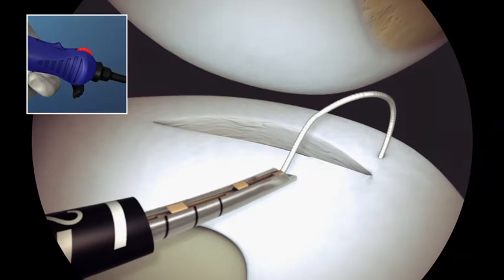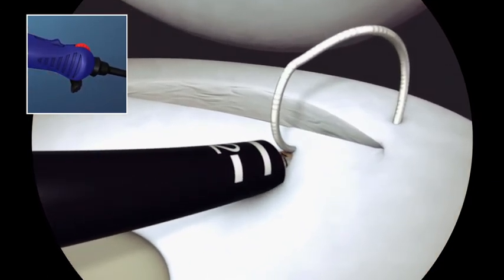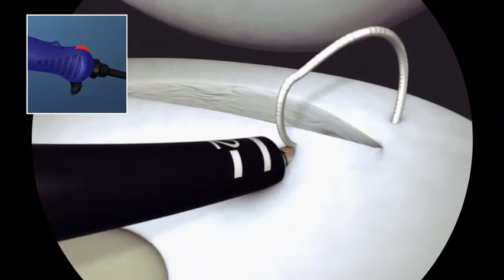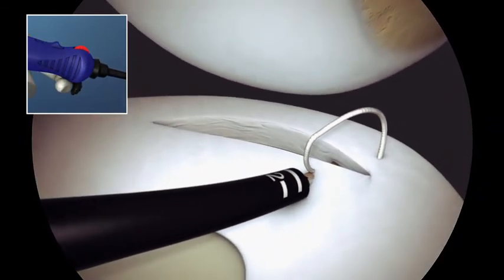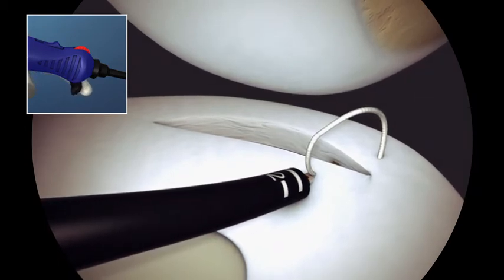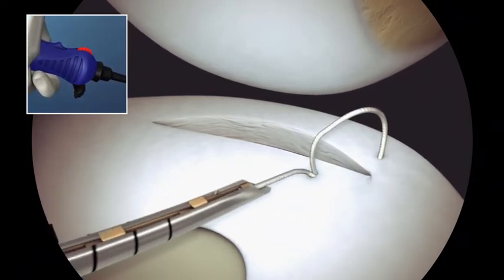To place the second implant and fix the stitch, again pierce the meniscus. Rotate the device two full revolutions, engaging the knotless fixation. Advance the trigger forward to prepare the device for implant deployment and then pull back and release to deploy the next implant.